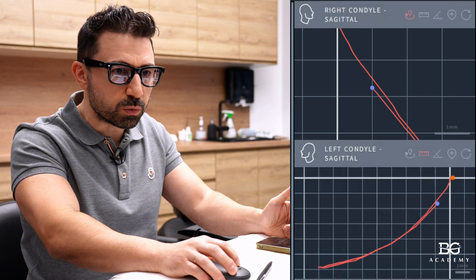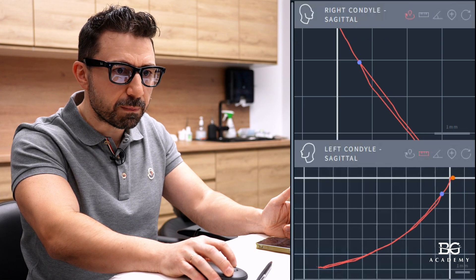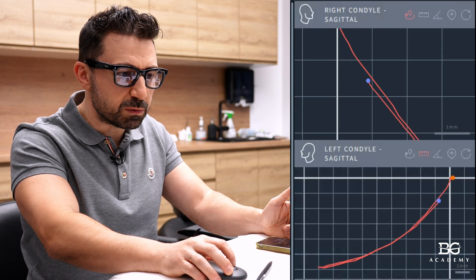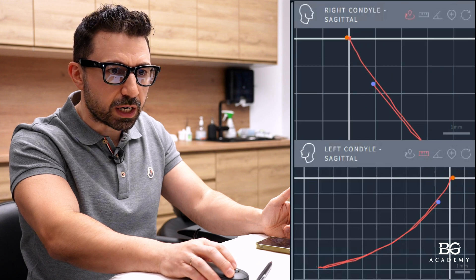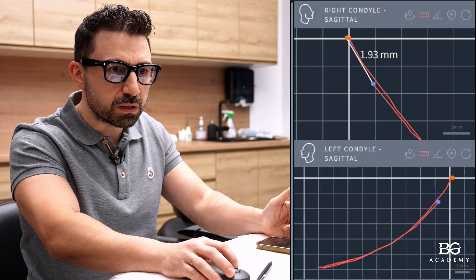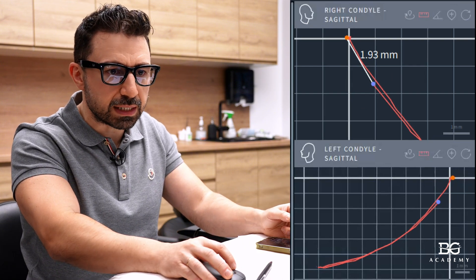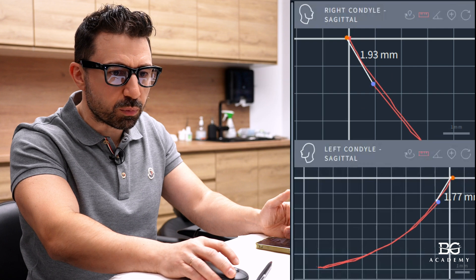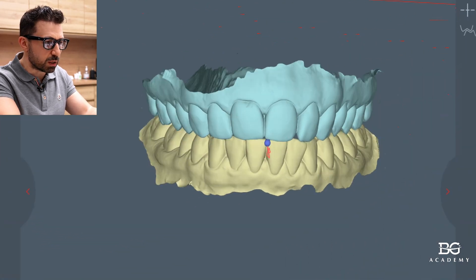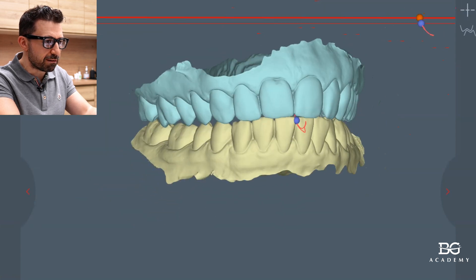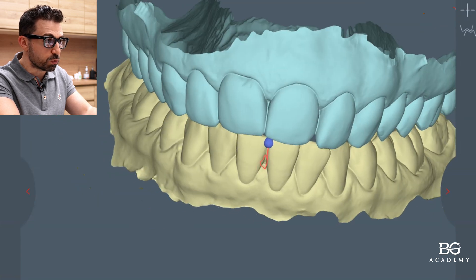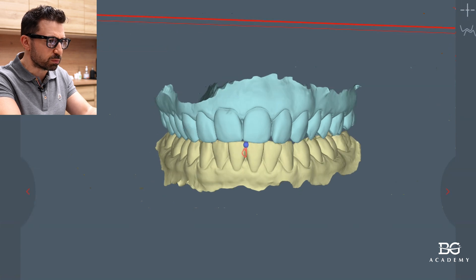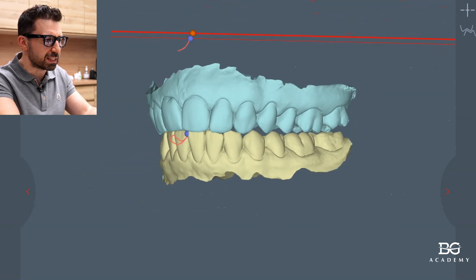Let me double check — the moment she still stands on the disc. I think it will be safer if I go a little bit more forward, on this belly area. So I'll stand on this position. Let me check again: it is about one, almost two millimeters in the protruded track — let's say 1.9mm on one condyle, and 1.7mm on the other condyle. So here is our estimated therapeutic position where she will have no click, no complications, no complaints. Now I need to give this position to my dental technician to test-drive it with a stabilizer splint that holds the mandible in that position.